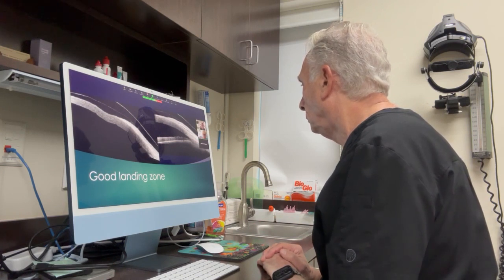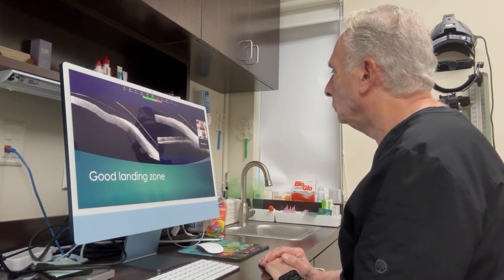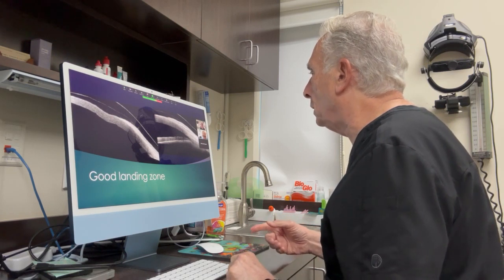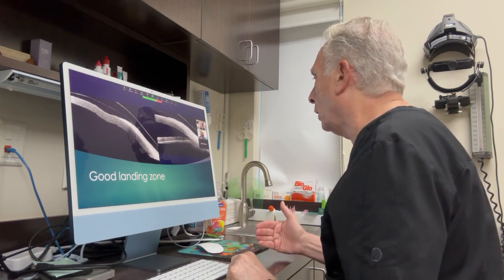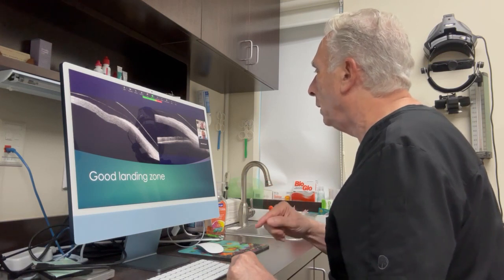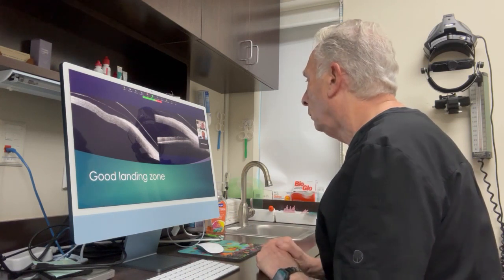When you're using the iPrint Pro impression, do you have to send the lens back to do some other changes? I don't send the lens back. If I need more clearance, I'll tell the lab I need an extra 100 microns of clearance, or I'm getting some limbal staining, or there is an impression at 3 o'clock or 9 o'clock. I'll take photographs, send the photographs and all the imaging to the lab, and call them on the phone. They look at my images and photographs while I'm looking at them, and they understand what I need. They make up new lenses. We don't send the lenses back.